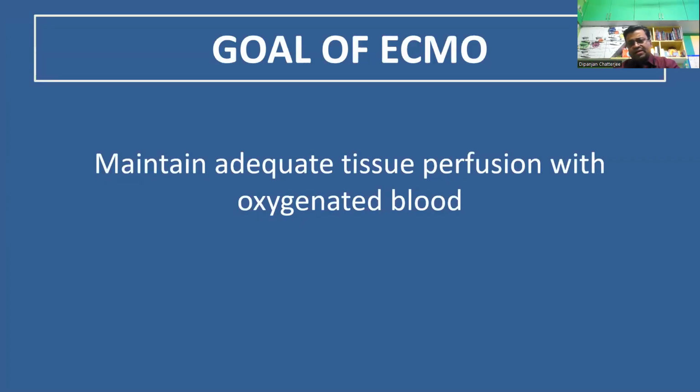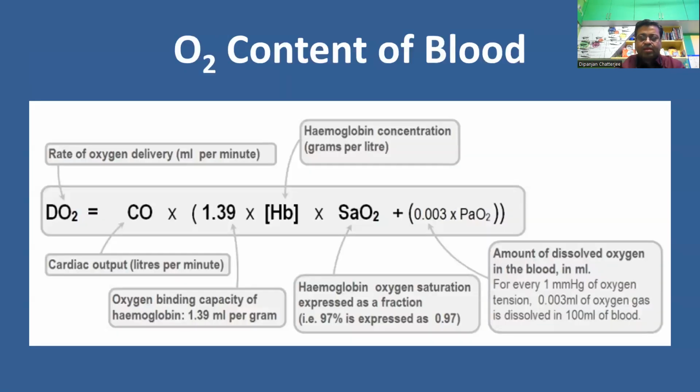This is my favorite slide. What's the goal of ECMO? It's always to maintain adequate tissue perfusion with oxygenated blood, that is, delivery of oxygen to the tissues.